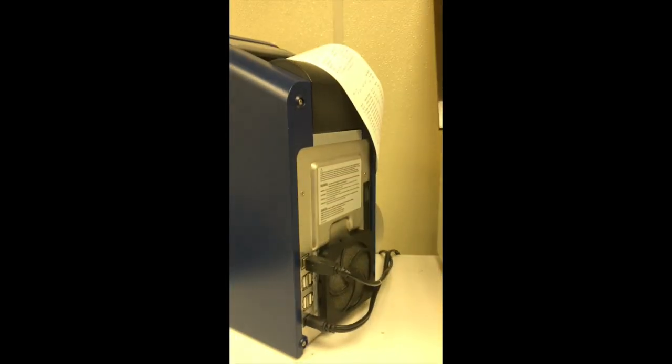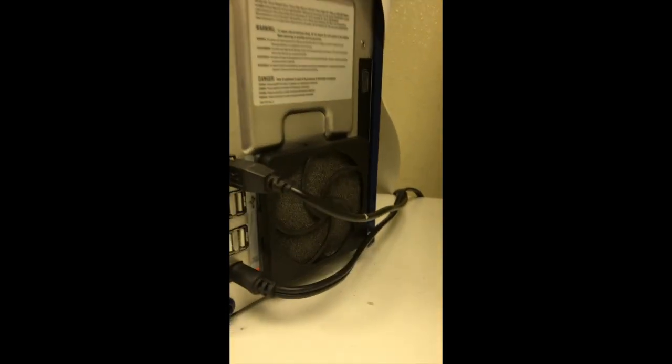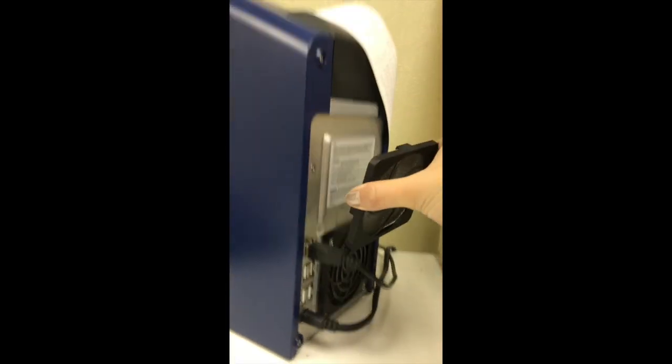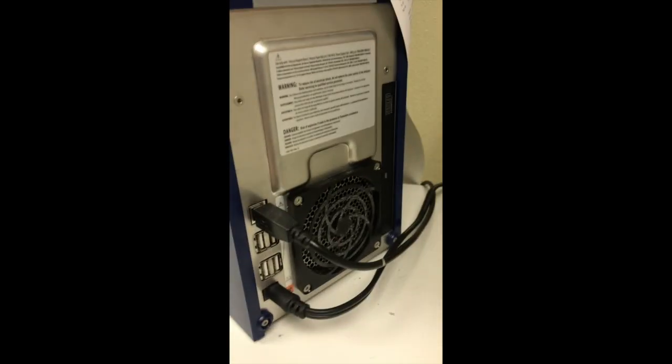The only real maintenance that we do is change the filter, which is right here. So I'm going to take it out, just like this. As you can see, there's the filter, and this is the filter that we change.